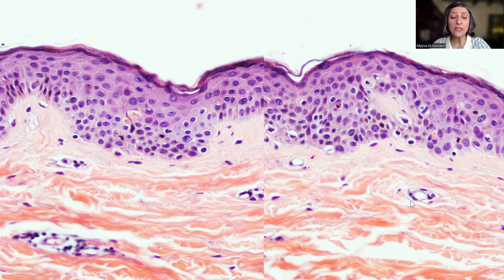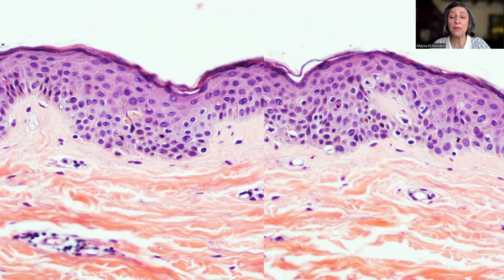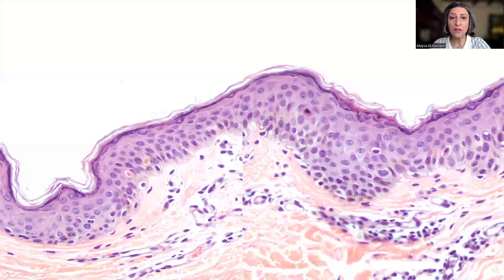The upper dermis is almost unremarkable. The vessels are okay, the collagen is okay. So really, the primary site of injury is within the epidermis.